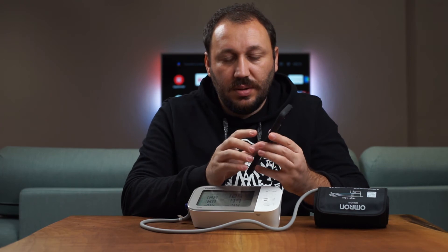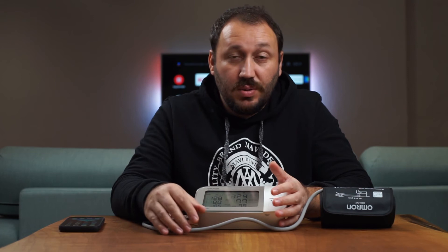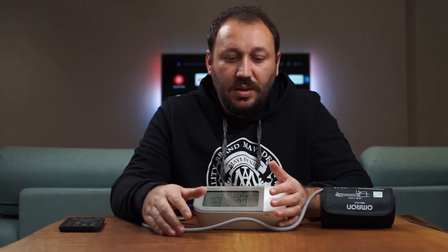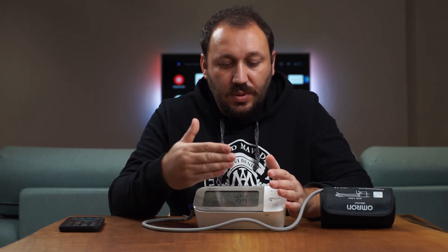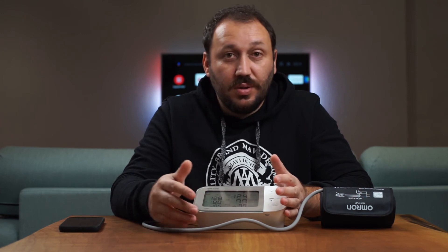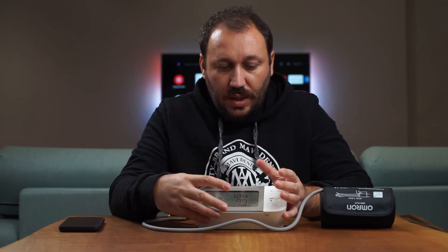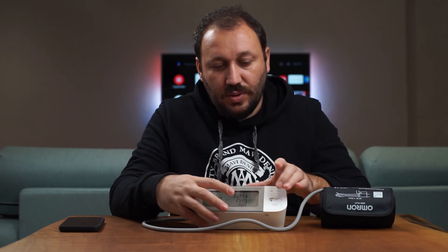Omron has done some kind of agreement with Apple Health so the readings sync automatically. For comparison, I have a Wyze smart scale and I cannot send those values to Apple Health in the same way. With Omron it syncs automatically, so you can monitor everything in one place. The data is also recorded in the Omron app and optionally stored in the cloud.